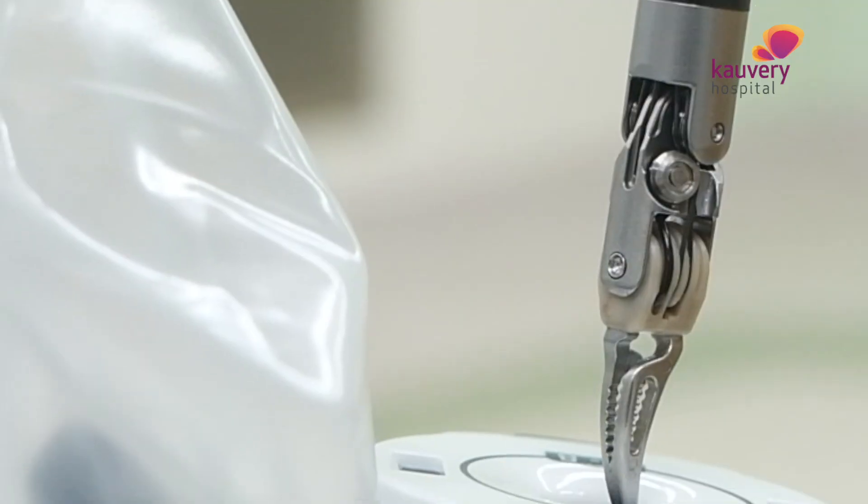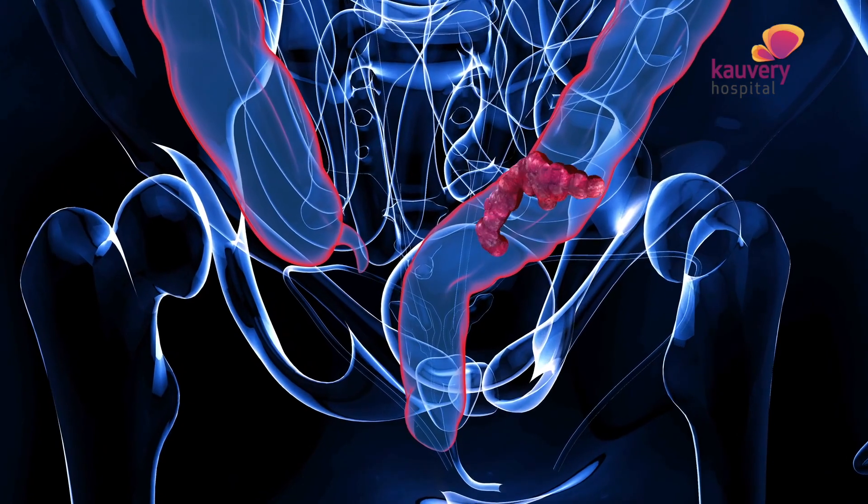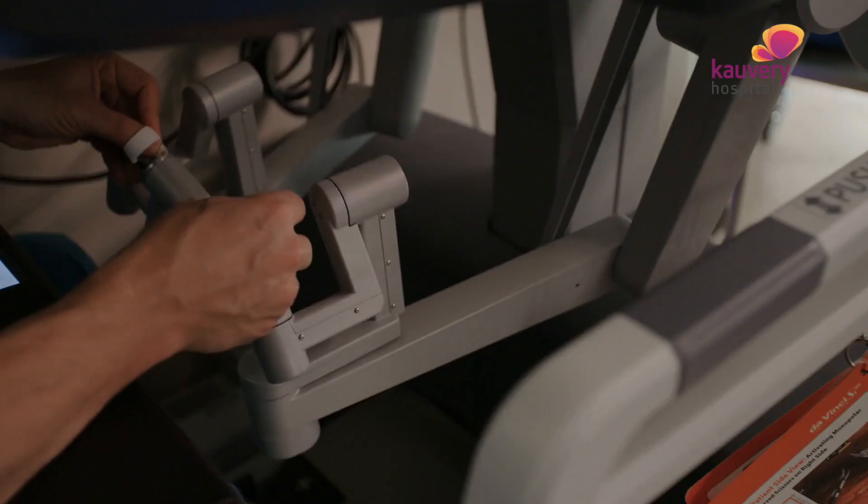One question is whether robotic surgery can be safely used for cancer. The answer is yes — if we can remove the cancer in open surgery, we can do the same procedures robotically. We can remove the cancer and the surrounding tissues just as effectively, and critical structures like main vessels and nerves can be preserved.